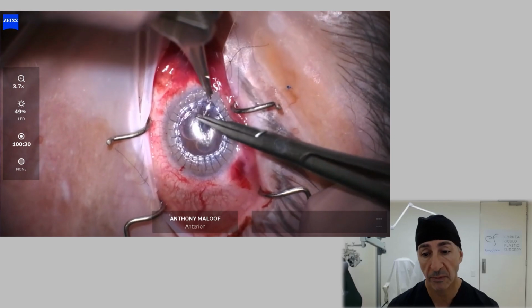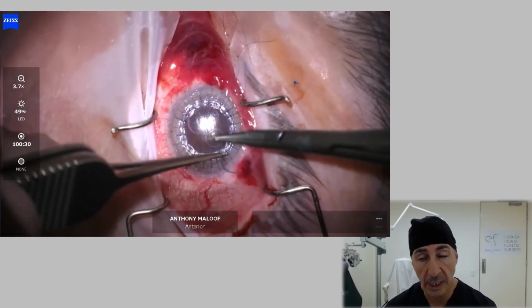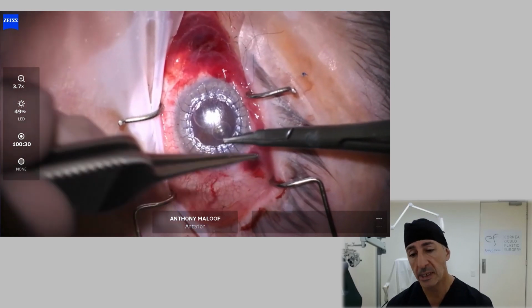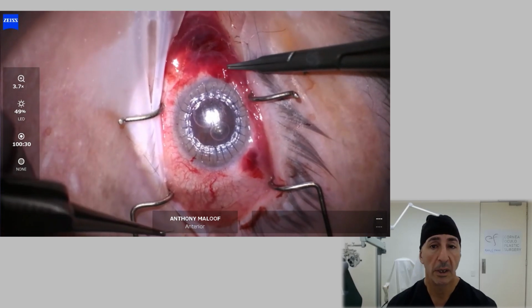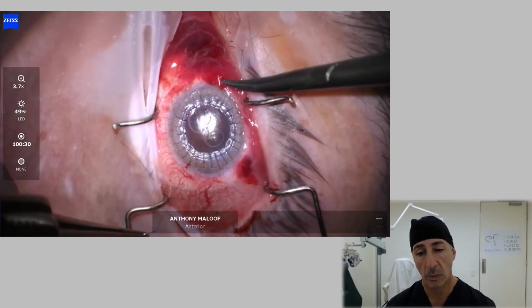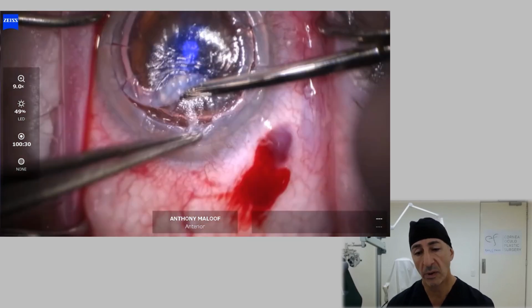When I saw him post-operatively, beautifully clear cornea, completely epithelialized. Vision is about the same. And here's the thing that happens. You have a very unstable anterior segment. These don't respond like any other corneas, but what I want to do is remove endothelial rejection, endothelial failure, cataract, all that other stuff that goes with full transplantation.